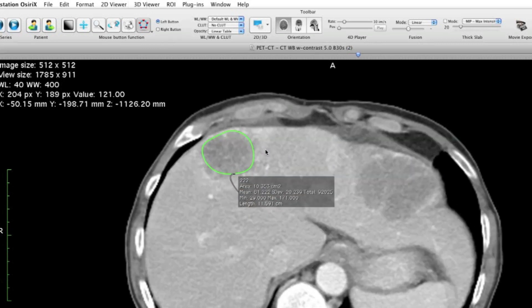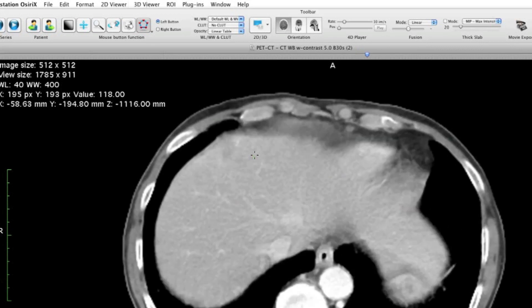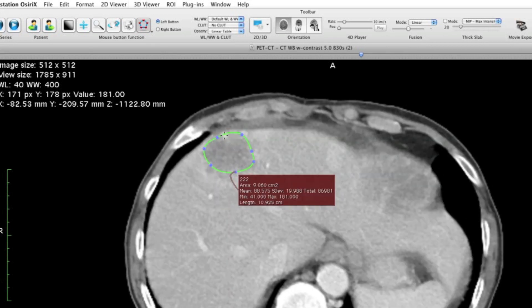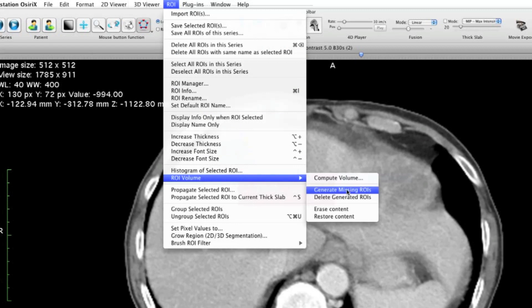If you do not see the ROIs highlighted, click on your ROI tool in the toolbar, then click on one slice with an ROI so that you see the blue control points. Then try again with ROI > ROI Volume > Generate Missing ROIs. The last step is easy: click on Compute Volume and OsiriX will calculate the volume for you.